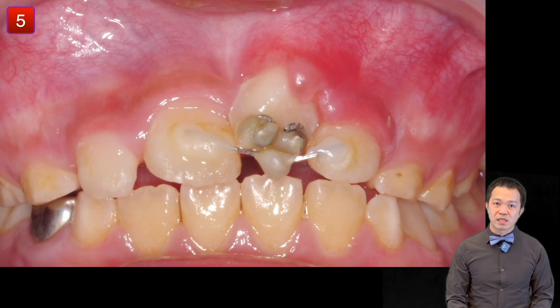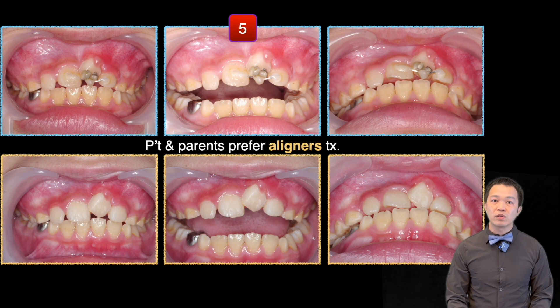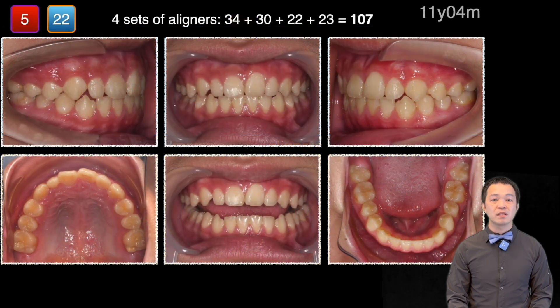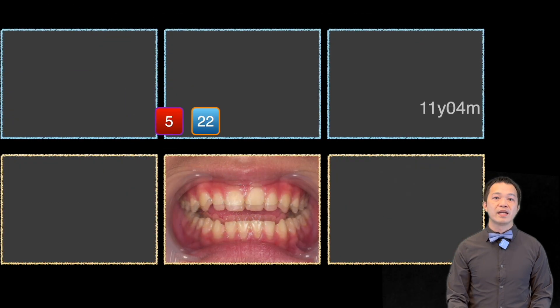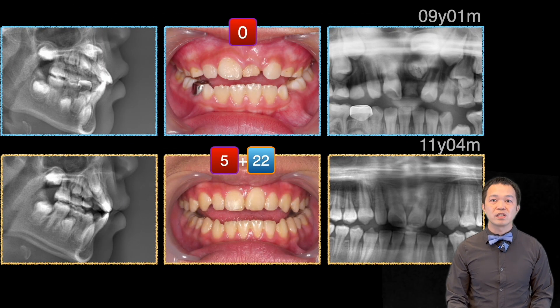By the fifth month, I removed the devices. I told the parents we could proceed with bracket bonding for the final alignment, but they preferred aligners due to less pain and discomfort compared to braces. It took four sets and a total of 107 aligners over 22 months, totaling 27 months for the entire treatment. At the end, I suggested further adjustment, but they were satisfied and didn't want to continue due to the patient's poor compliance.